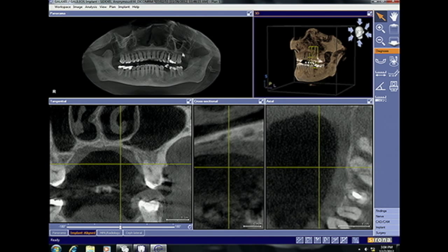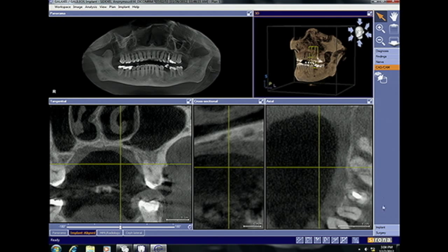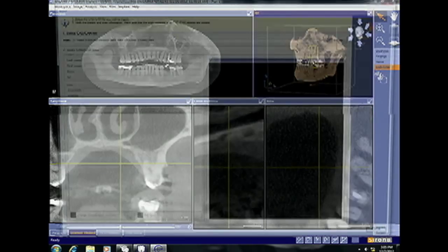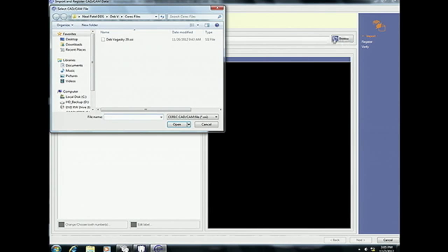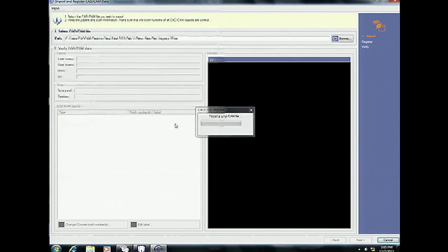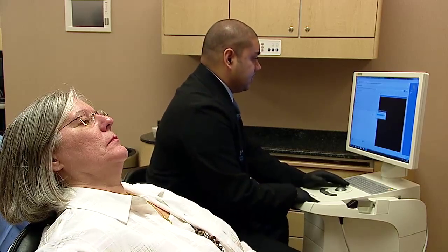The protocol that I follow in my practice is to always start with the tooth first. So importation of the CEREC restoration within the software is fantastic and it's easy. There's a CAD-CAM tab here on the lower right-hand side. When we click on that tab, you can open a file and browse for the appropriate file. We exported this at an earlier stage, so we're simply opening up that CEREC CAD-CAM file, Deb, as you can see here.